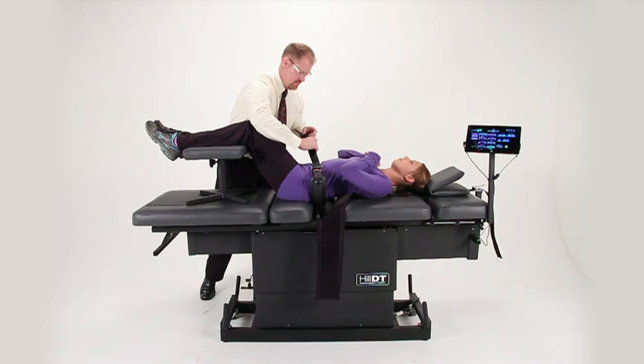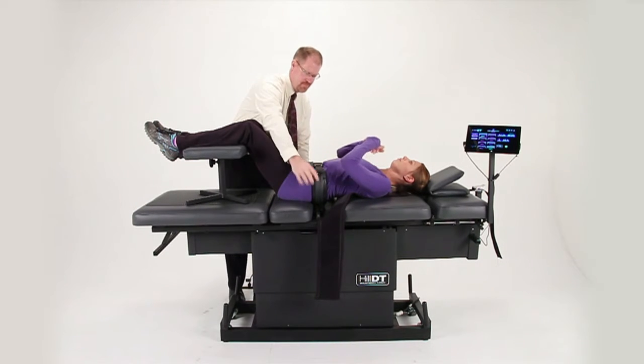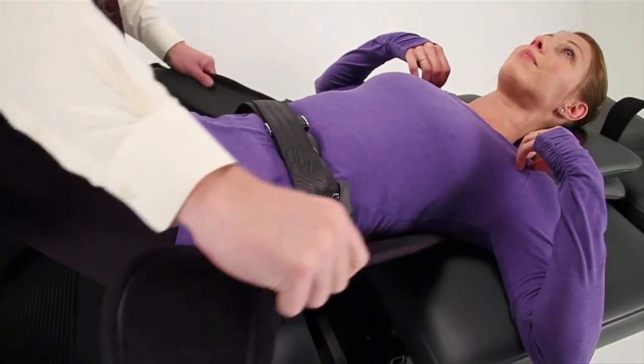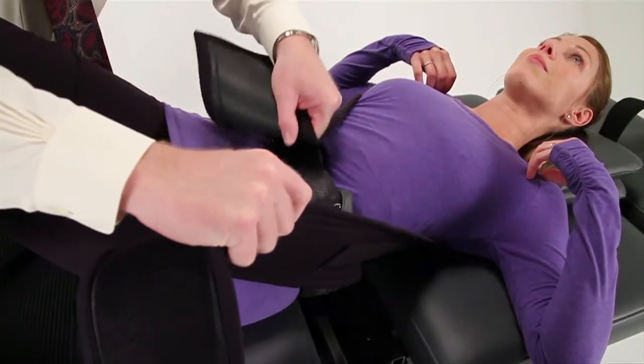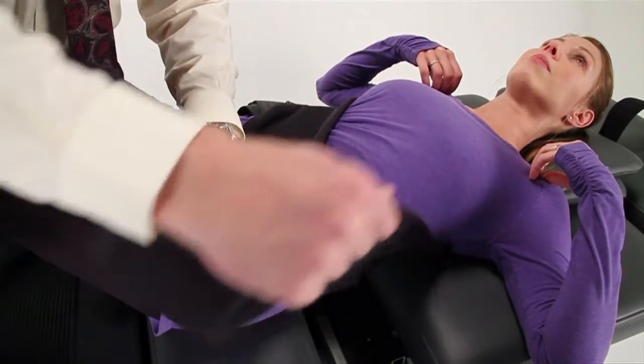Push in on the straps, click the buckle, and firmly tighten the belt. Position the thoracic capture so that it wraps firmly and securely around the patient, making sure that the Velcro sections are well connected.